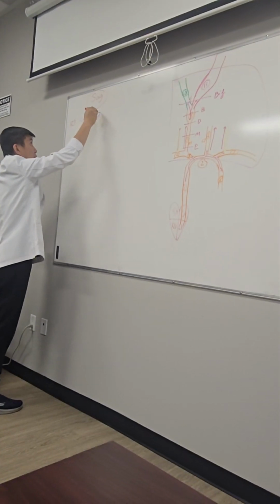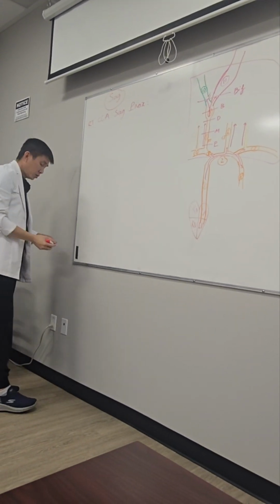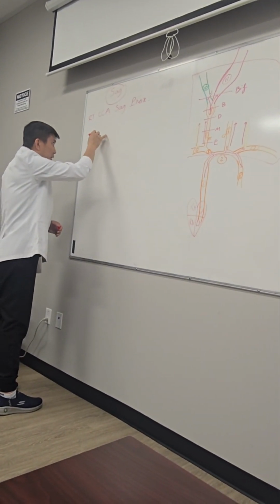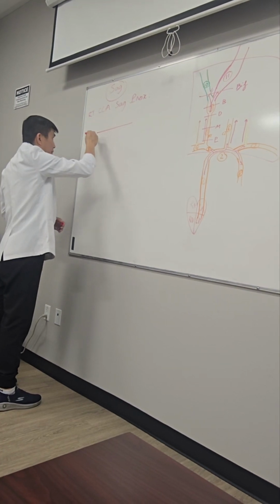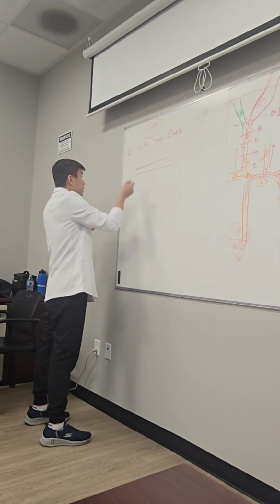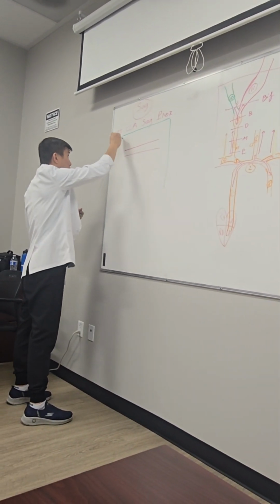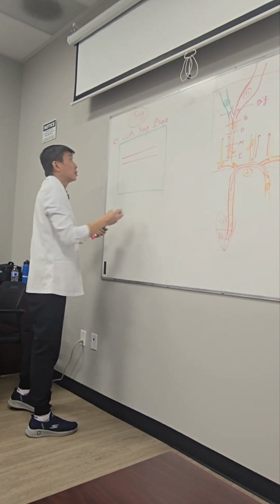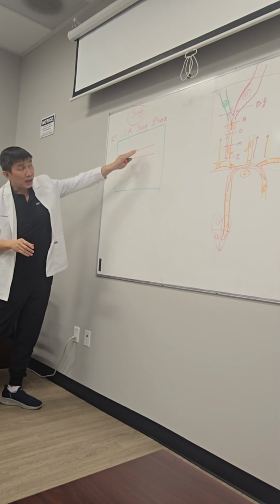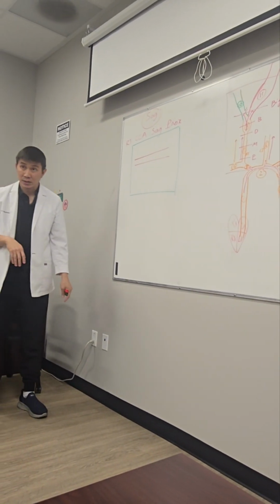CCA, proximal. So you're going to open the CCA completely off the screen. This is the screen with the B mode. You need to adjust the B mode again to make the inside of the CCA completely clear.